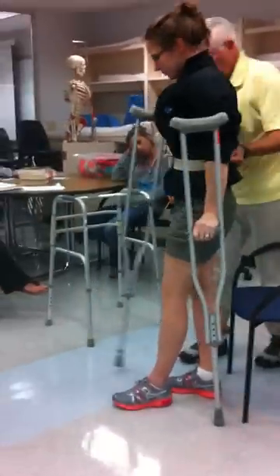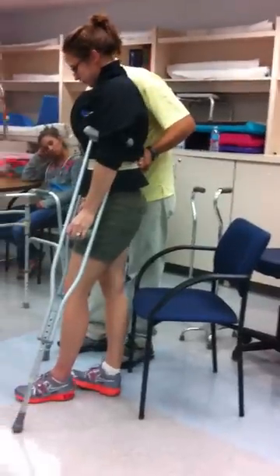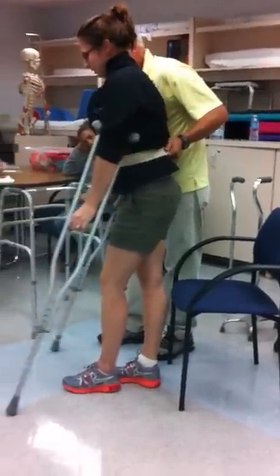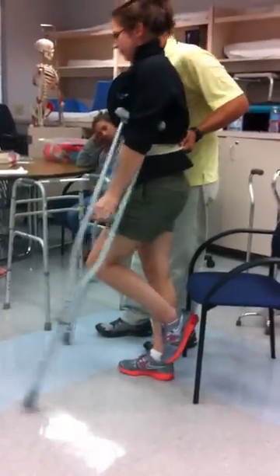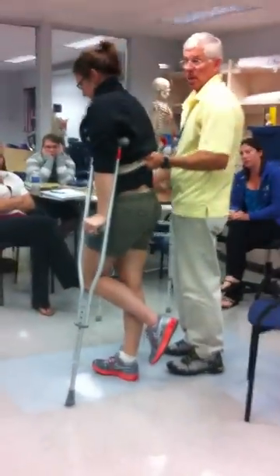Take that outside crutch and roll it on your knees. Take your crutches forward. You're non-weight bearing. Crutches — pressure on your hands. Little step. And I've got her.